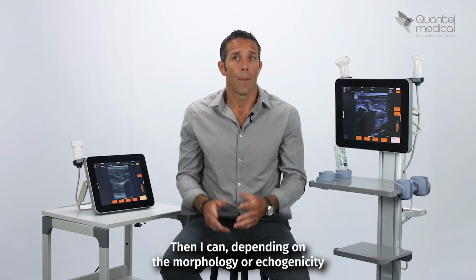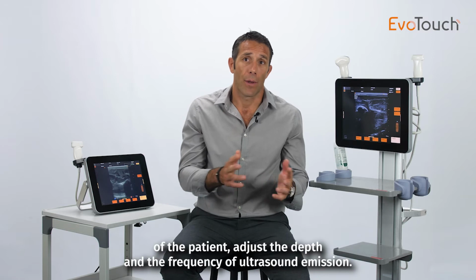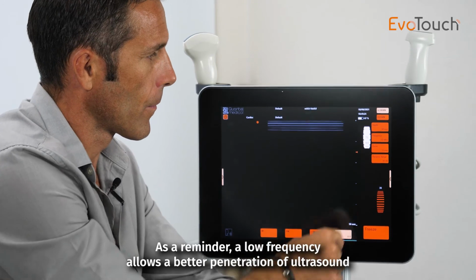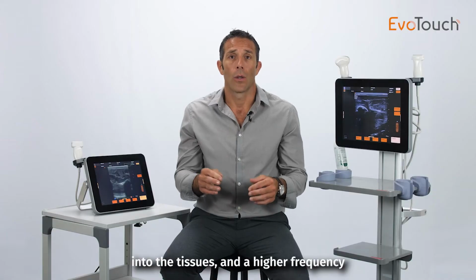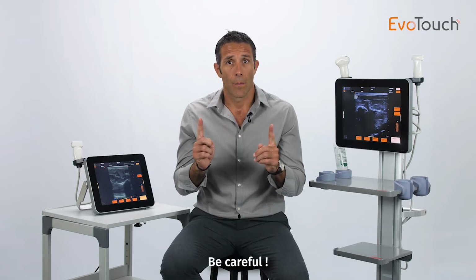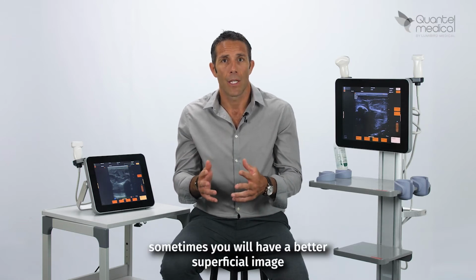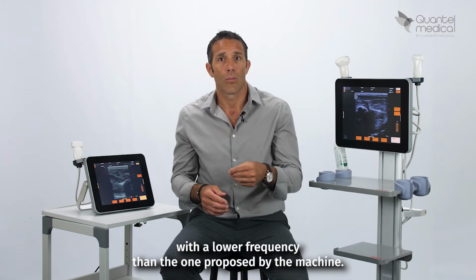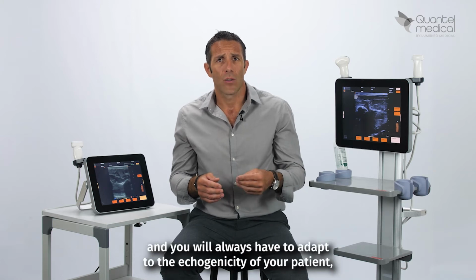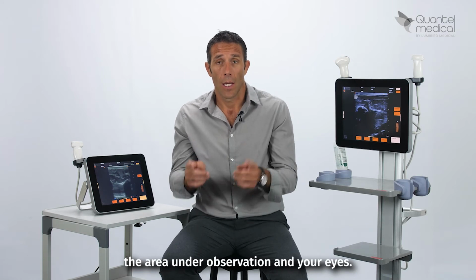Then I can, depending on the morphology or echogenicity of the patient, adjust the depth and the frequency of ultrasound emission. As a reminder, a low frequency allows a better penetration of the ultrasound into the tissue, and a higher frequency allows a better image on the surface. Be careful, it is not an exact or absolute rule. Sometimes you will have a better superficial image with a lower frequency than the one proposed by the machine. It's a permanent game of compromise, and you will always have to adapt to the echogenicity of your patient, the area under observation, and your eyes.